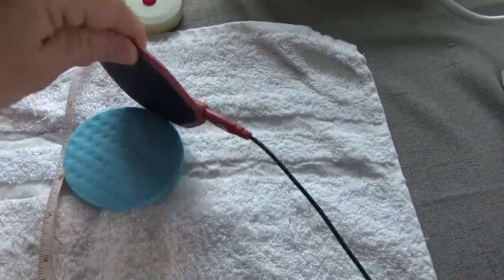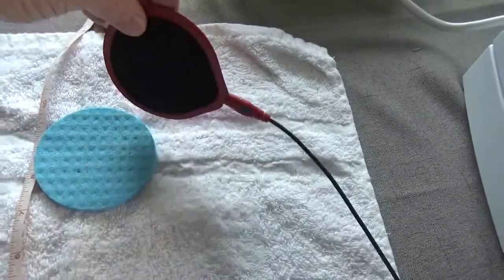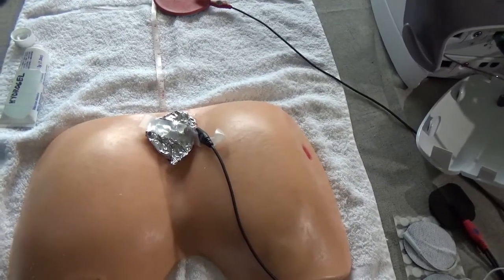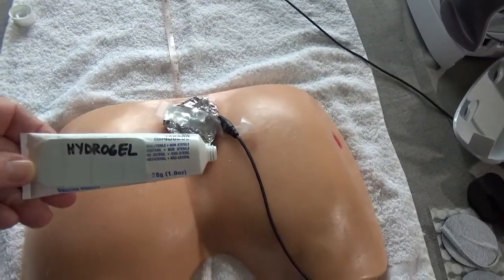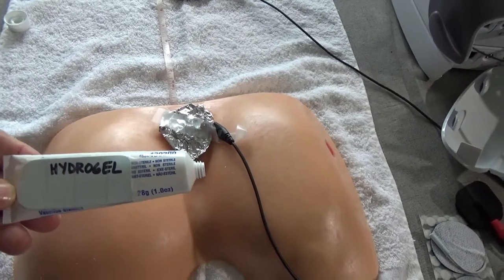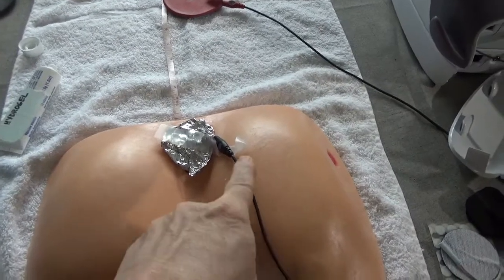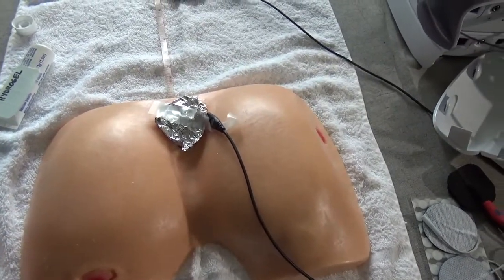Underneath this electrode is a sponge that's been moistened with water or saline and it is secured to the patient. The patient has to be in a comfortable position to stay here about an hour. If it's a smaller wound and you don't want to put the saline gauze in it, you can simply put hydrogel in the wound and put the tinfoil right on top of the hydrogel — that's perfectly acceptable. This is a monopolar setup; if I had another cable I could bifurcate the one coming into the wound and treat another wound or another location at the same time.